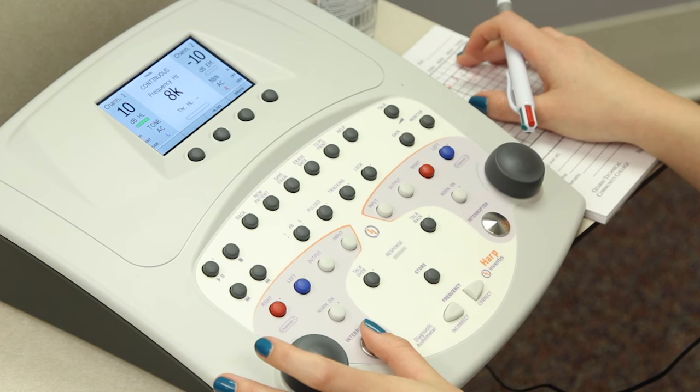Mr. Ruth Buck, can you hear me? That concludes our air conduction test today.